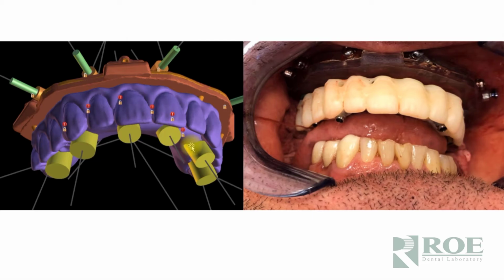And you can see a lot more detail on that in other videos of rotating the implant for indexing, and then seating the MUA abutments according to the carrier guide notches. There are many indicators on there to give the doctor the important tools and information to index the implants, because you want the temporary cylinders to be straight and hopefully parallel. Not all are parallel, of course, because it's not always possible with the bone.